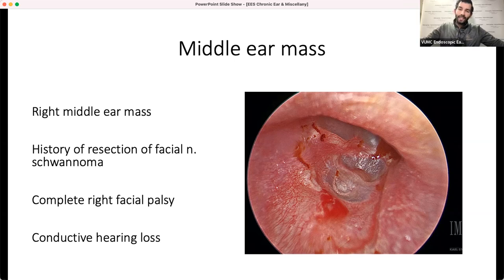Now, where do you end up making that cut? So imagine you've made your tympanomeatal flap and everything is elevated up to the level of the annulus. Then you visualize where your perforation is, and you take a micro scissor and cut your flap, including the annulus, including the native drum, towards that perforation. So essentially, instead of a sheet, now you have two leaflets, a superiorly based leaflet and an inferiorly based leaflet. That makes it super easy sometimes, because then you can keep elevating the annulus inferiorly and park that leaflet away from you. And then as you flip the superior leaflet out of the way, you're right at the malleus. And those are the cases where I would not totally deglove the malleus.